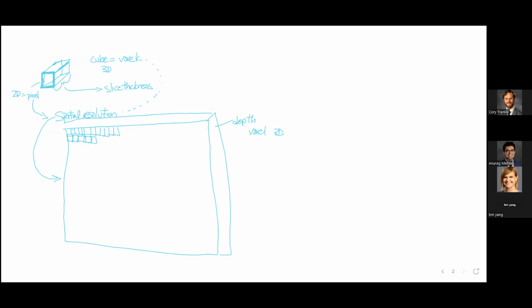We were doing MRIs from their toes to the top of their head. Slice, slice, slice, slice, slice. And what were we doing? We were measuring their mass. We were looking at their muscle mass, their heart mass, all these things. We had to draw regions of interest around every single muscle bundle in their body. It took like a month to do one because it was all by hand. It all had to be verified and checked. But that's how we learned that when you're in space, you lose muscle mass, right? And then we had to come up with exercises and all this.